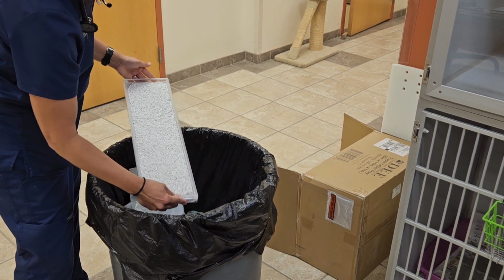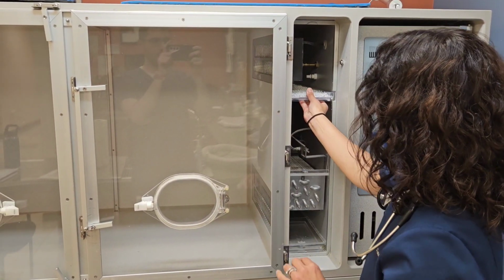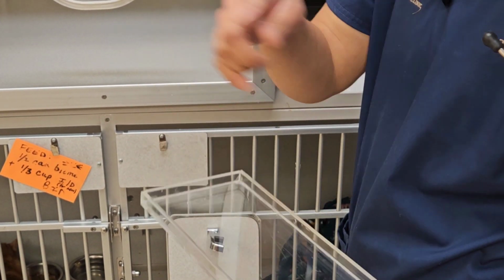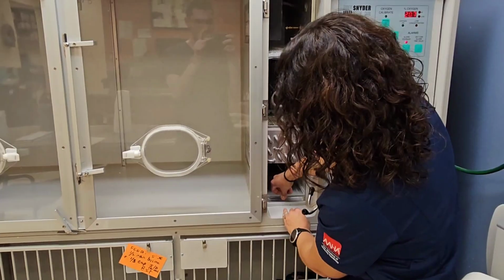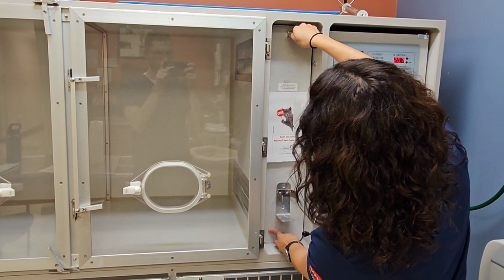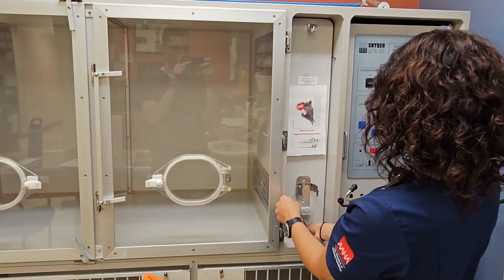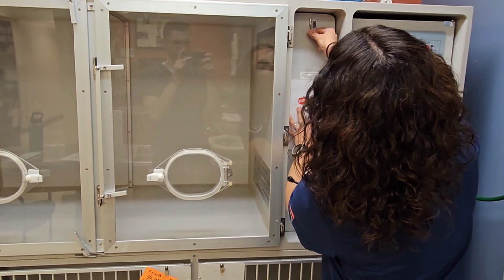Put that back in, and under here is a little tray that collects condensation. So if there's any liquid in here, you just want to take it over to the sink and dump it out and place it back right here. And then to put this back on, just kind of angle it in like that, and then I turn it. Can't get it to turn, but anyway, you would lock it down like that, and it's closed.